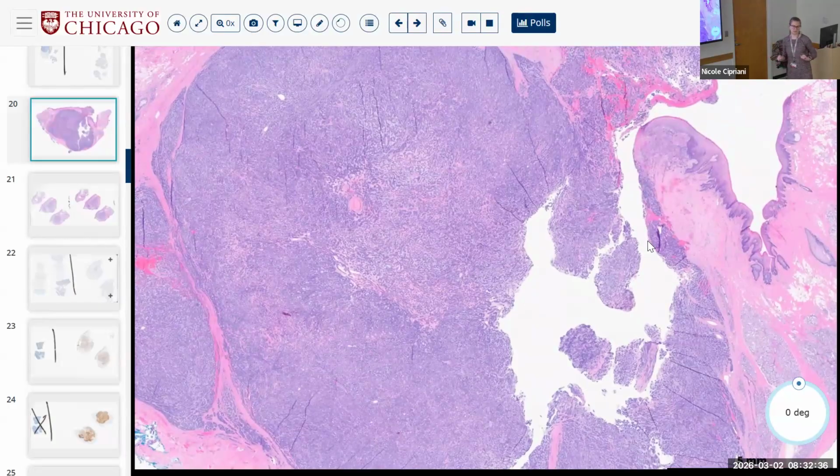I can't call this adenoid cystic, but theoretically it's still in the differential because not all of them have the fusion, or it might be cryptic. So it would be uninformative. If it has something else, like HMGA2 or PLAG1, that's helpful, right? But if it has nothing, then it's unhelpful. And they'll have to manage clinically, right, with what they feel clinically is happening. Those are the cases in which sometimes they freeze, where they're like, I don't know.